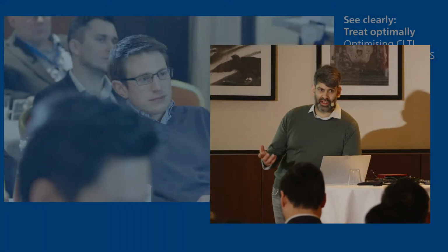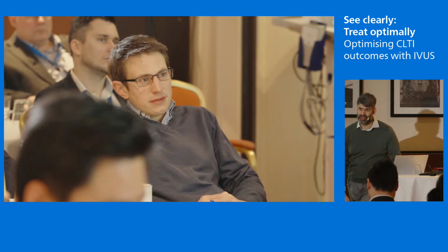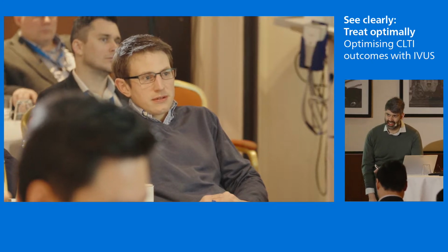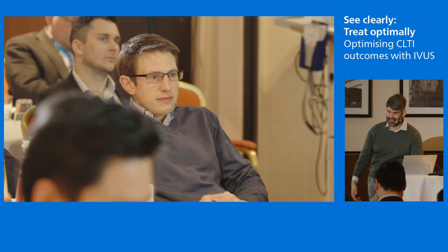Jetstream is for the much larger vessels, heavier calcium. IVL is eating into some of that business now for sure, but that's again where IVUS will help me decide what's the anatomy of the CTO. Again, there's another phenotype that you'll all recognize, which is a 20 centimeter CTO, which is mostly soft plaque, and then there's just a 1-inch segment of calcification in the adductor canal, which was the culprit lesion that started off as a heavily calcified stenosis and has turned into the CTO.